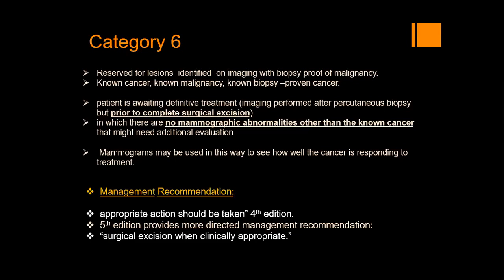If we have done a mammogram and the only findings we could see correspond to the known biopsy-proven cancer, and for this biopsy-proven cancer there is no history of complete surgical removal, these two are important to categorize the lesion as BI-RADS 6. Imaging may be used in this way to see how well the cancer is responding to treatment, like for neoadjuvant treatment patients.